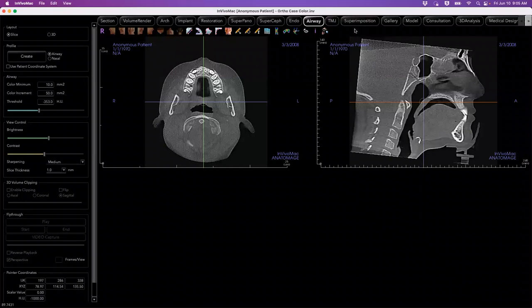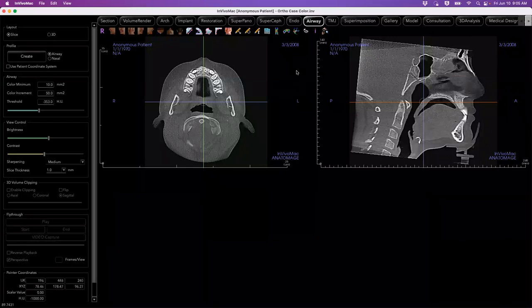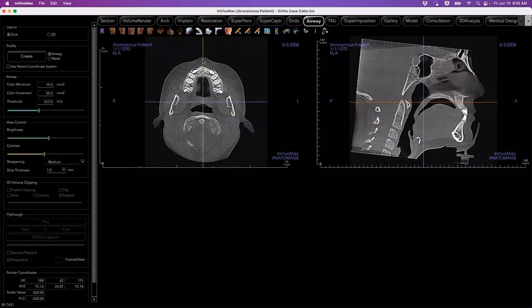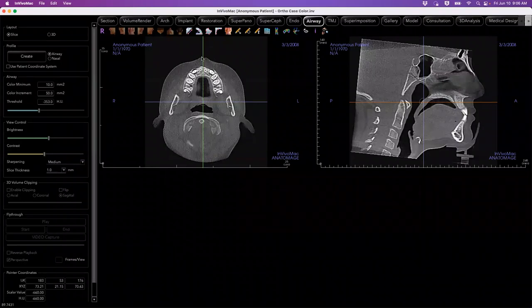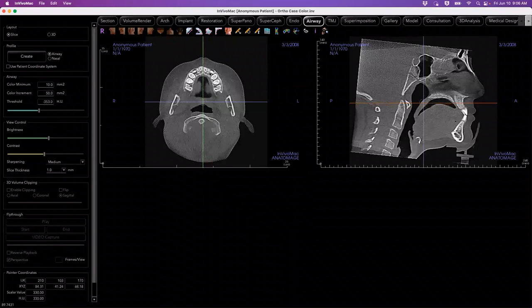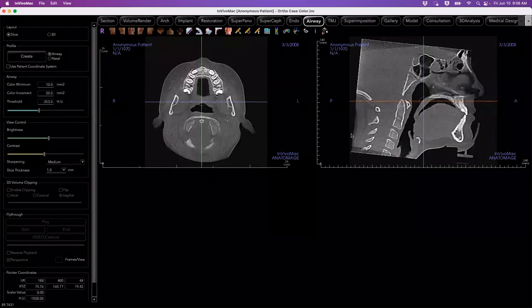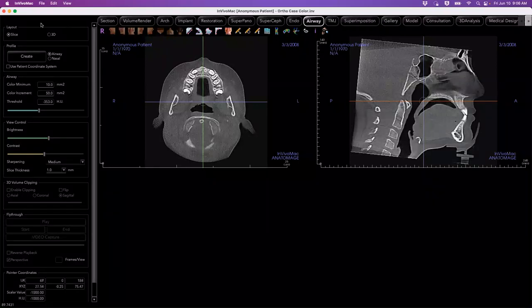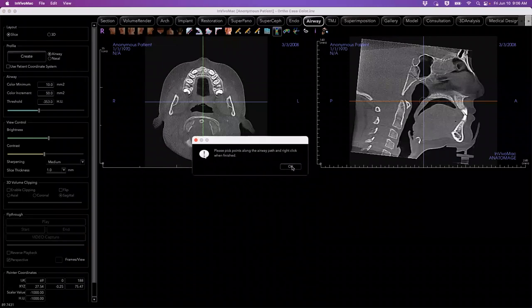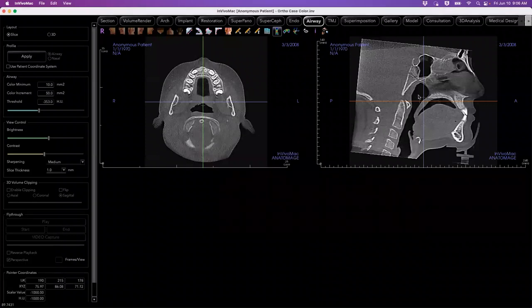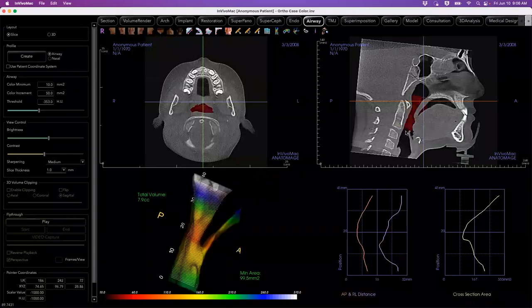Since I'm already on the airway tab, let's jump right into it. You'll see our axial and sagittal views that automatically generate when you click to this tab. In our sagittal view, we want to make sure it's being cut down our mid-sagittal plane, which will help us isolate our airway as well as our nasal passages. This tab also provides a great endoscopic view of the internal anatomy structures of the airway. To get started, I can scroll through these different slice views. If I hover over my sagittal view, I can make sure I'm in a nice mid-sagittal cut, and then click create airway.